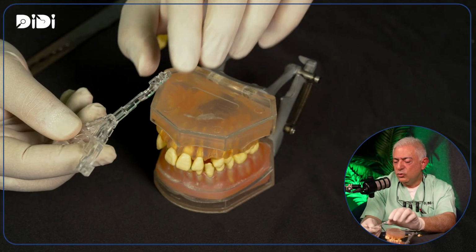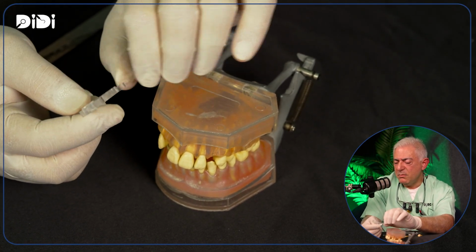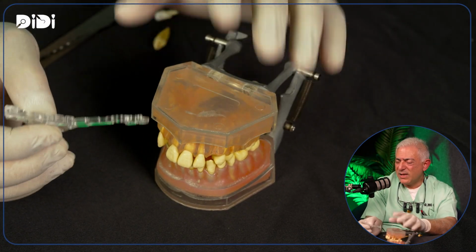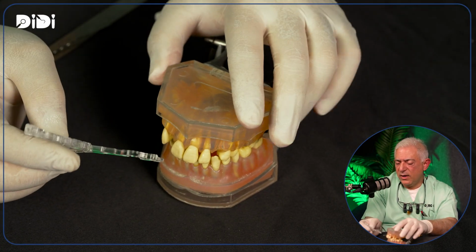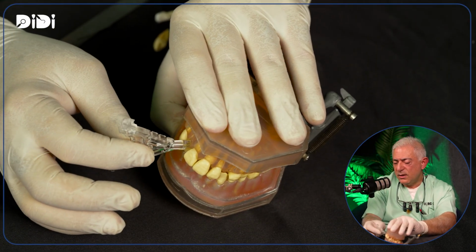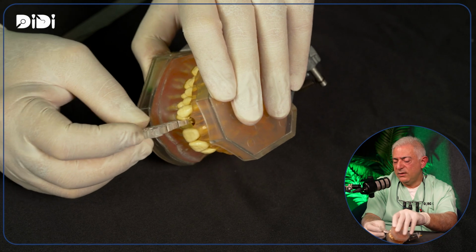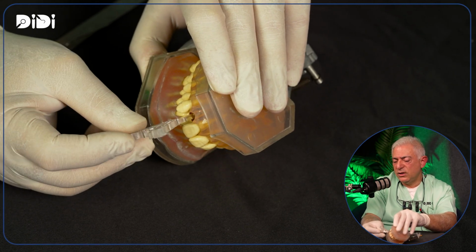Then you go to the other part, which is 5 millimeter, which is the minimum space you need for a screw retained restoration. Because after 4.5 millimeter, it's not possible to give a screw retained. So if 5 millimeter is going in, that means you can place a restorable screw retained restoration in this occlusal vertical dimension.